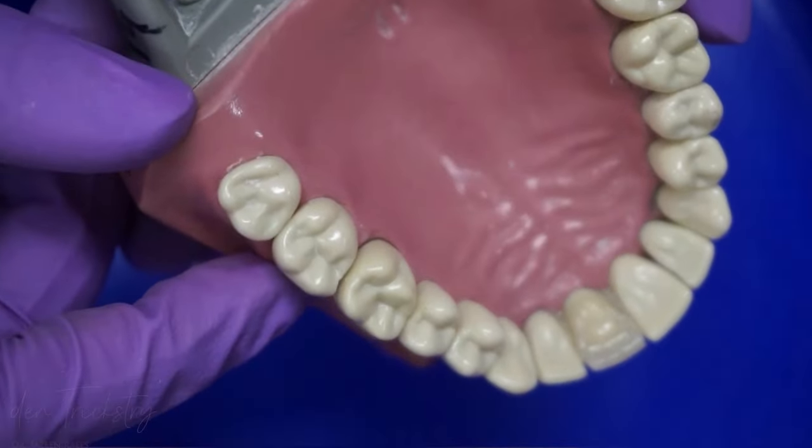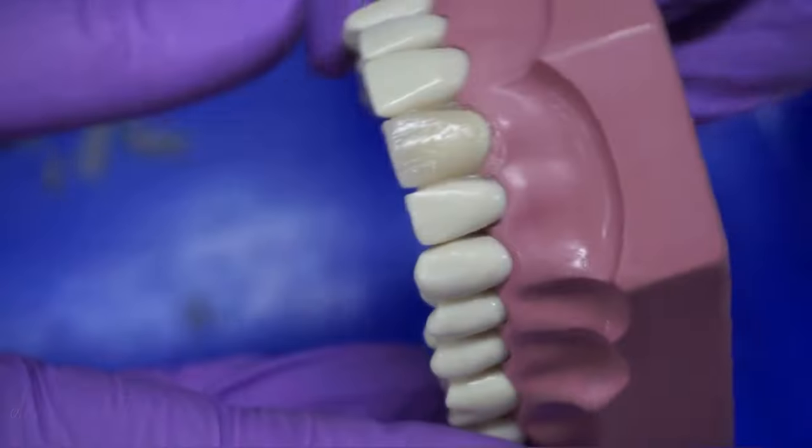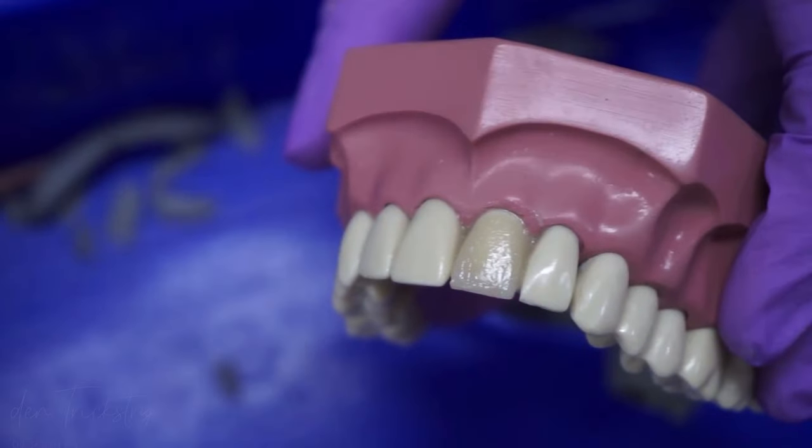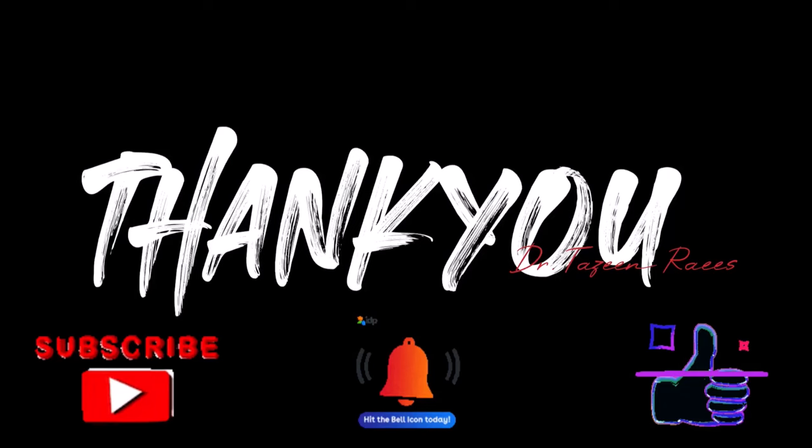Once you remove the index, as you can see, we are done and your immediate temporary crown is ready. Remove any excess material from the gingiva. Since this is a model, it is very difficult for the crown to come out and it gets fixed onto the tooth. One thing I missed in this video is the application of Vaseline on the prepared tooth surface. If you do that, the crown comes out easily as long as there are no undercuts.